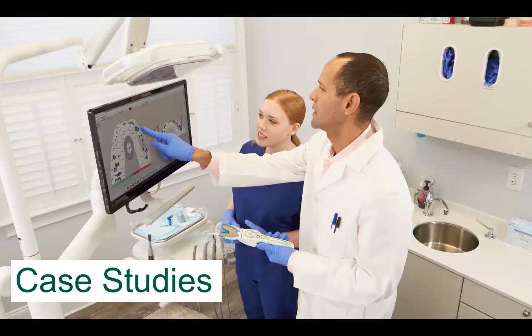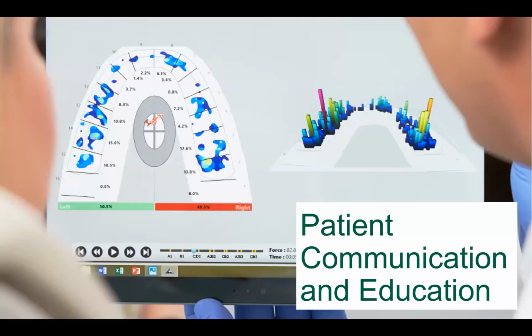So now that you've just been able to see the T-Scan Novus Core in action, I just want to spend some time, as I mentioned, going through some actual patient cases that are going to address some of the problems that we discussed and Alyssa talked about at the beginning of the webinar. And it seems like from the poll, at least, that you guys are experiencing these problems as well. So these cases will be very familiar to what you're used to.